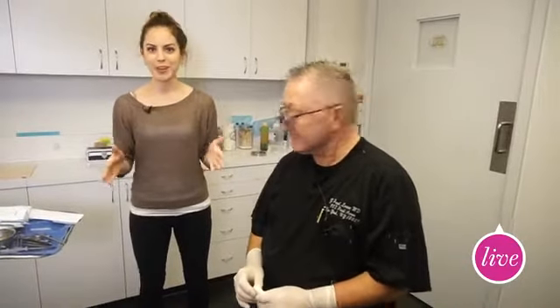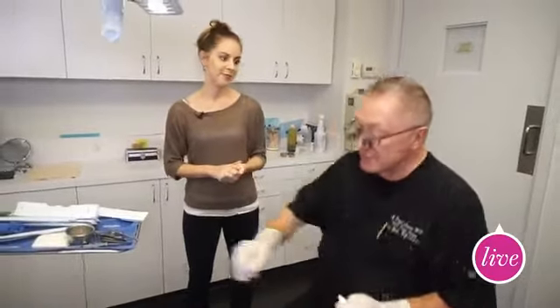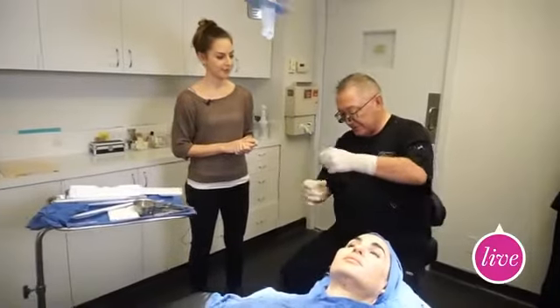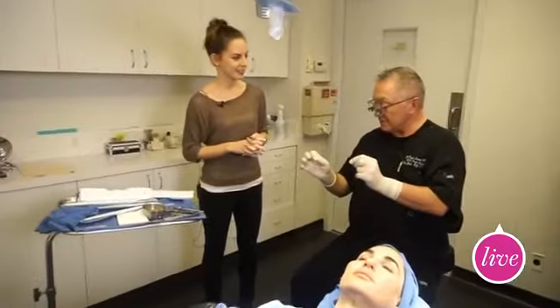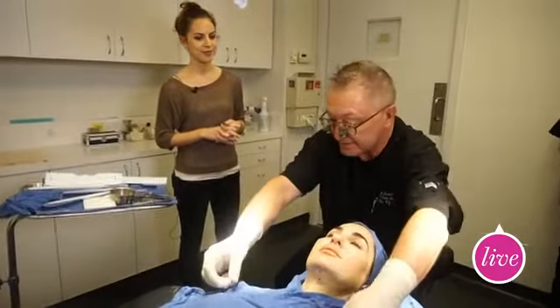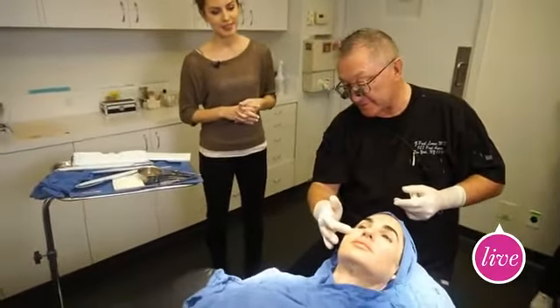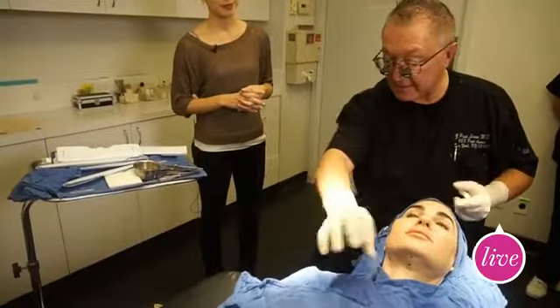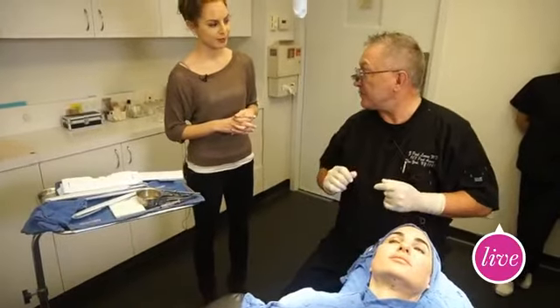But anyway, before we even demonstrate that, tell us a little bit about what this procedure is and who it's good for. So Silhouette is a suture that has little cones on it. As you can see, it's made out of completely absorbable material, polylactic acid and polyglycolic acid. It's sort of like Sculptra. Once I place it underneath the skin, it lifts the skin and the fat pads. But it also does something very interesting: as it's being degraded, as your body is processing it, it creates volume, because it's just like Sculptra.